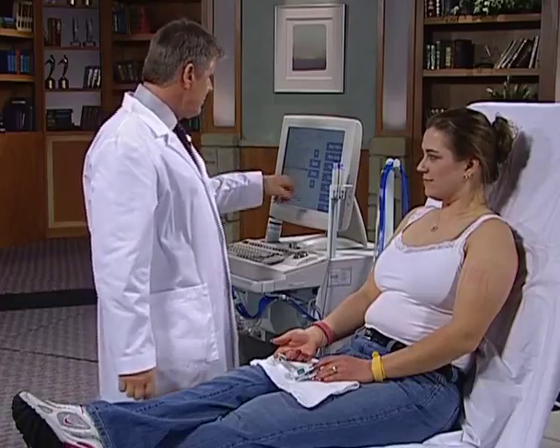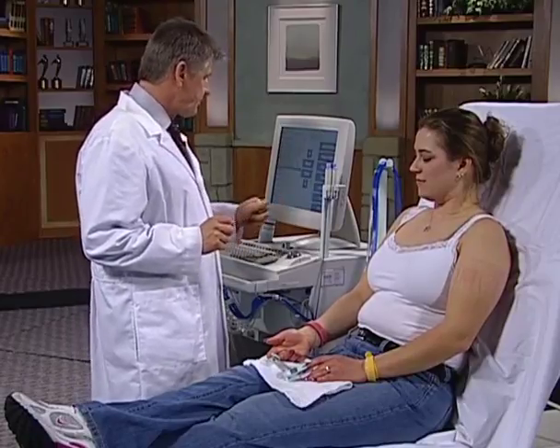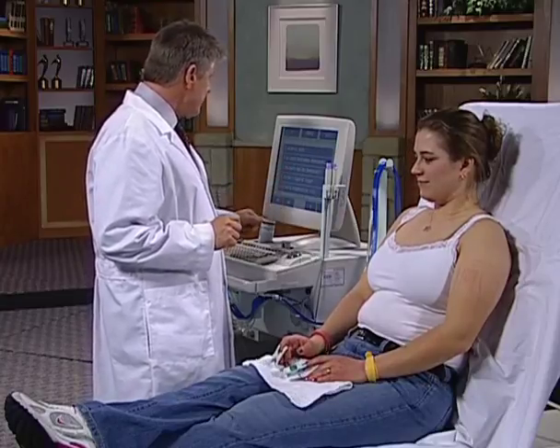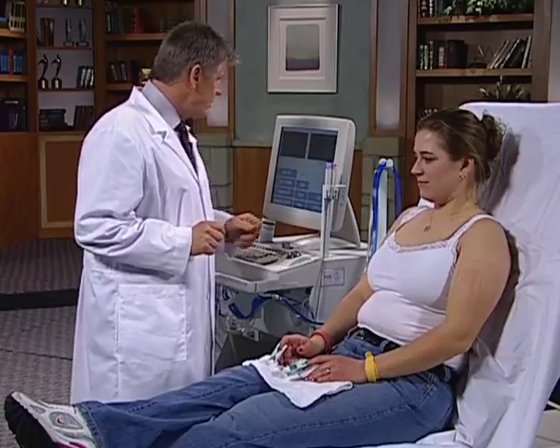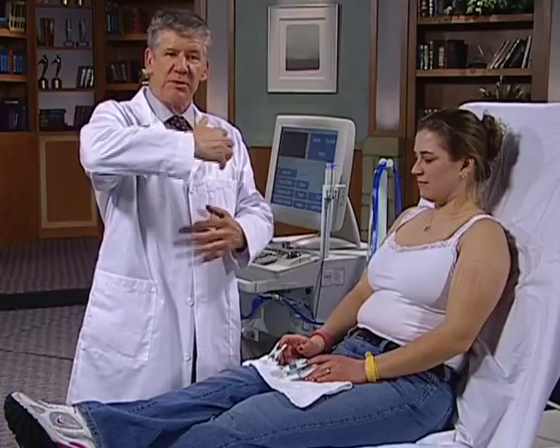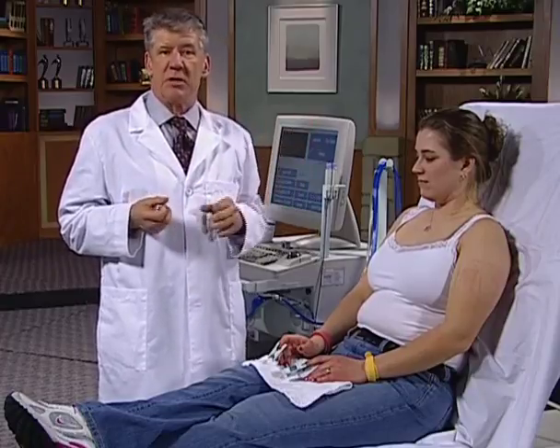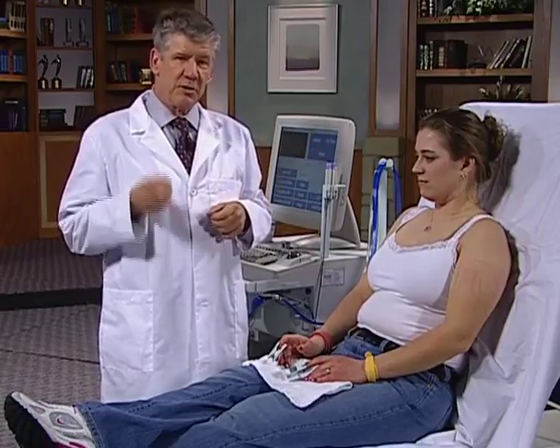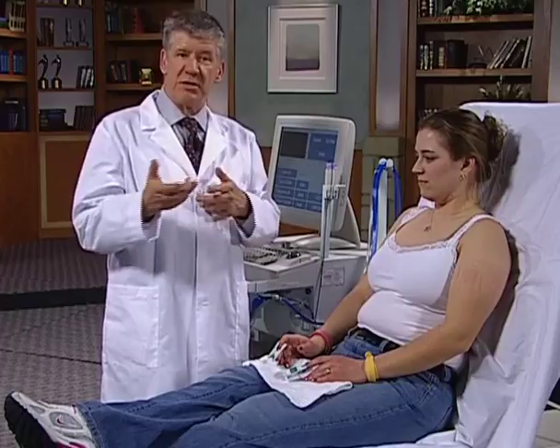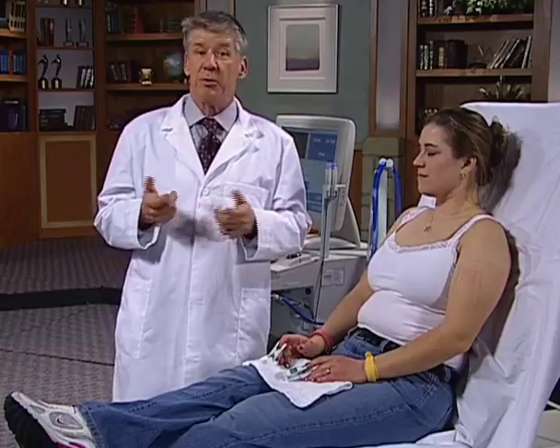Okay, the next view, we'll just go back here slightly. The next part of the test that we'd like to do is to go to what we call the symptomatic position. The symptomatic position is the most important of any of the modalities, in that we want to have the patient in the position in which they're complaining of their symptoms. If we can show a decrease in the PPG tracing, particularly if it goes flat line, in a symptomatic position, then we can relate that it's a vascular thoracic outlet with the symptoms. But if there's no change when they're in the symptomatic position, it's probably a neurogenic issue as opposed to a compressed artery.